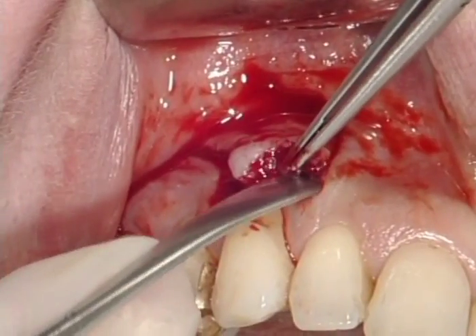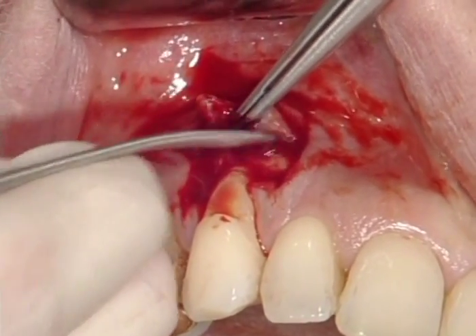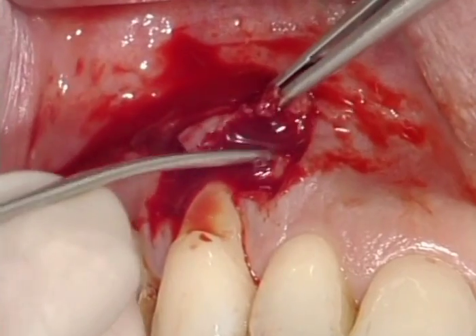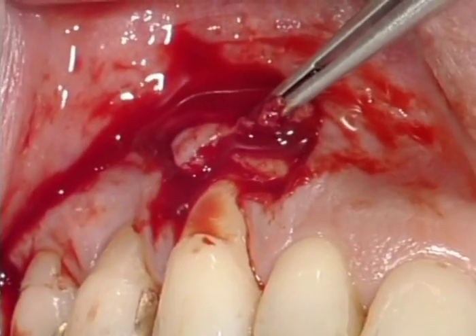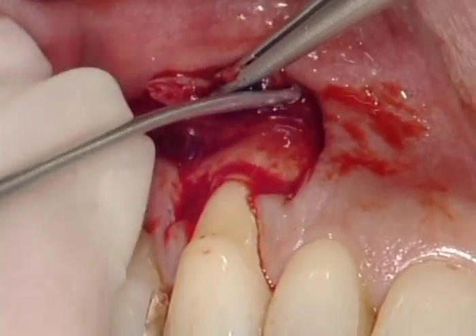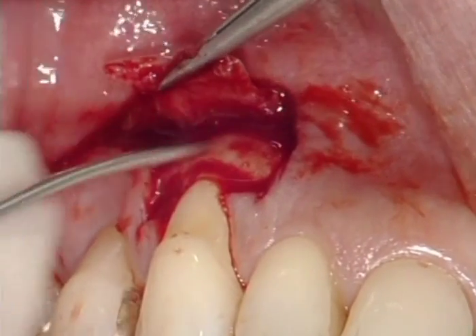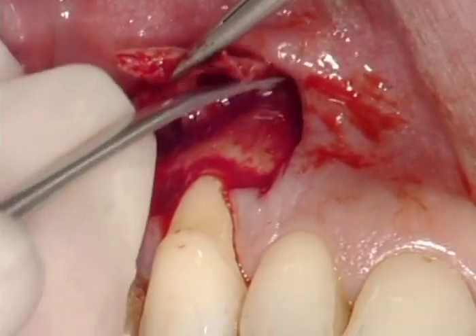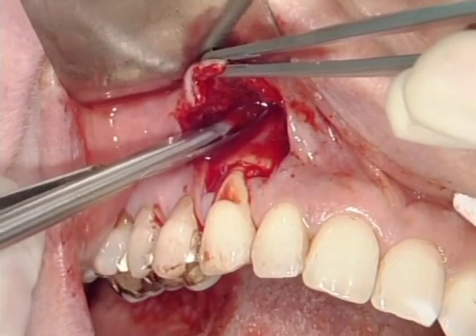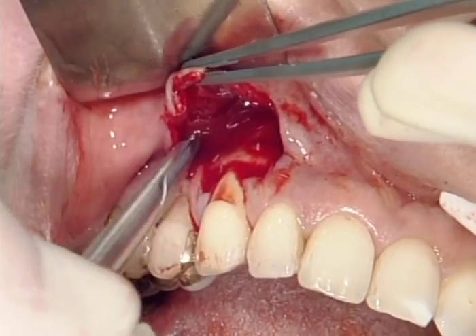A full thickness flap is raised with a mid-size raspatory until either the mucogingival junction is passed or the area three millimeters apical to the bone dehiscence is visible. A horizontal cut is then made in the periosteum.